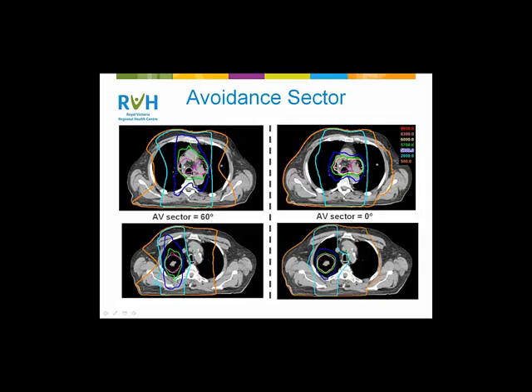Why not partial arc for the whole treatment? Fantastic question. We've looked into that, yes. And again, it's helping Eclipse out a little bit. You would think that the APPA fields are within the range of the fields that you deliver in the restricted arc, so they would be unnecessary, right? Why doesn't the system just slow the gantry down when it's delivering and put more dose through those angles because they're favorable? Well, it doesn't do that.